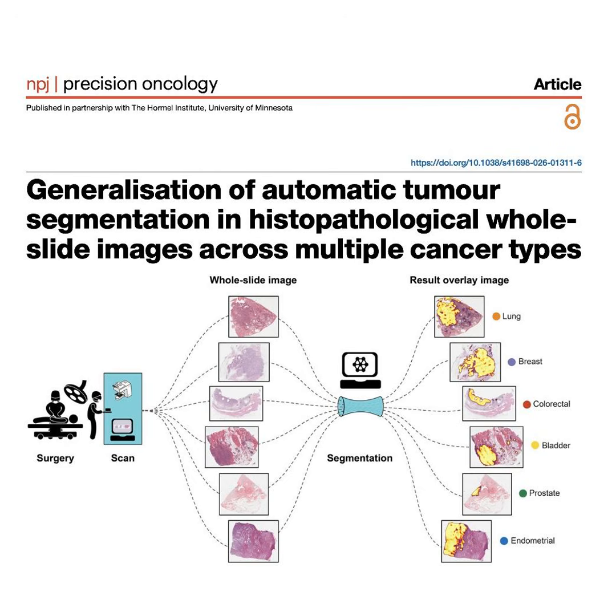Exactly. Pathologist MP meticulously annotated a set of slides. Then, 2 years later, without looking at his previous work, he re-annotated the exact same slides. Okay. He agreed with his past self 91% of the time. Which makes sense. Human beings aren't perfectly consistent robots. You know, our mood, our fatigue, our recent case history, all of that influences how we draw a boundary.